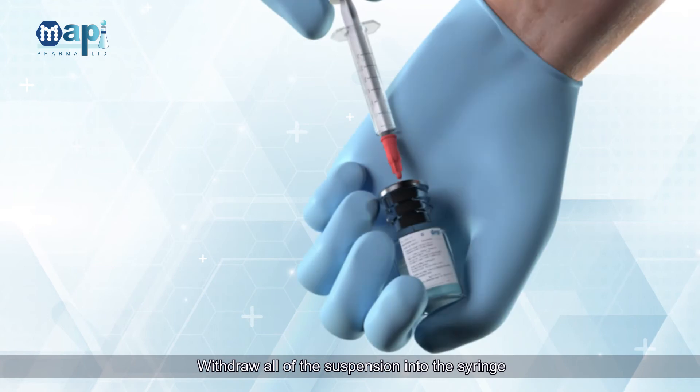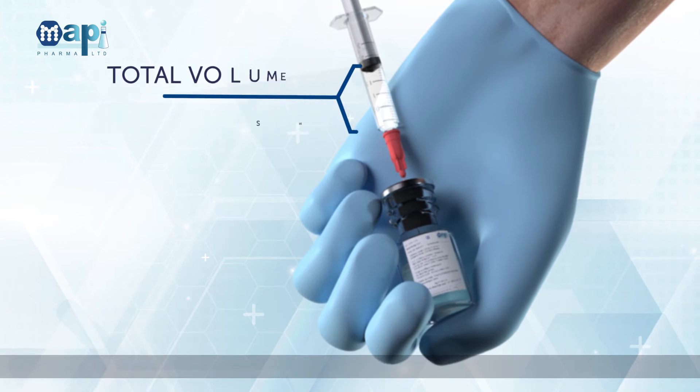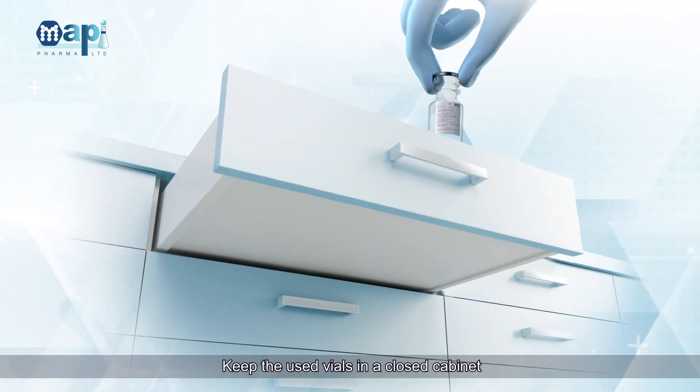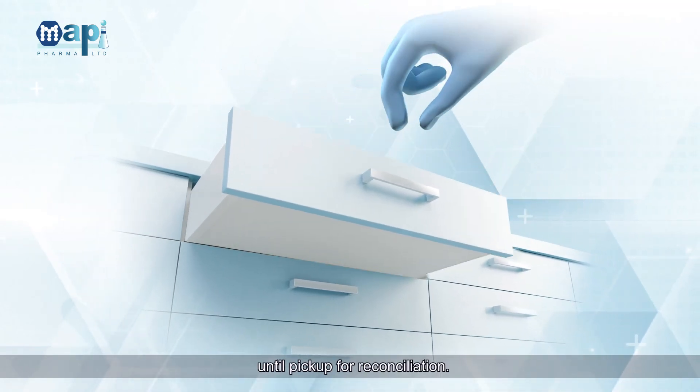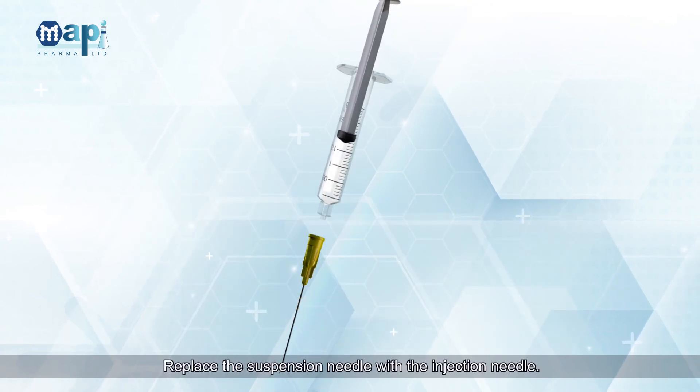Make sure all powder is suspended. Withdraw all the suspension into the syringe; total volume should be about 2 milliliters. Keep the used vials in a closed cabinet until pickup for reconciliation. Replace the suspension needle with the injection needle.